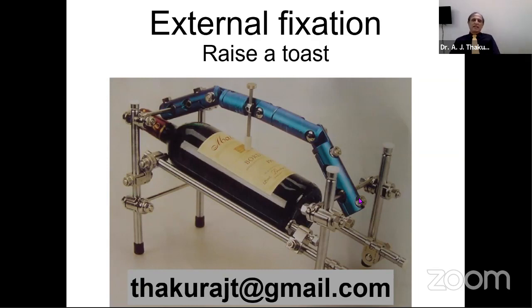It is very rarely that outside material by way of bone grafting is required as a stimulus. The main trouble is the instability. So one should think in those terms, reduce the instability to the beneficial level of 2 to 10, and healing would occur even without bone graft. But as it is traditional, applying bone graft, I would say make it stable and then apply bone graft, both will work. Alok, we have questions?